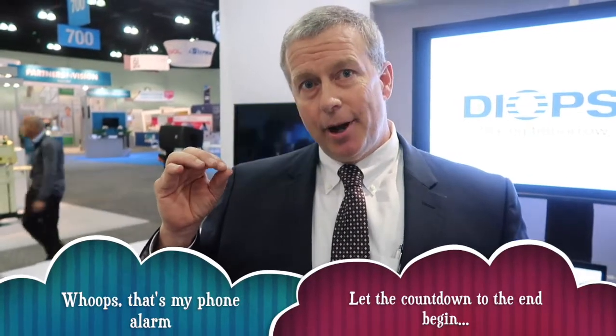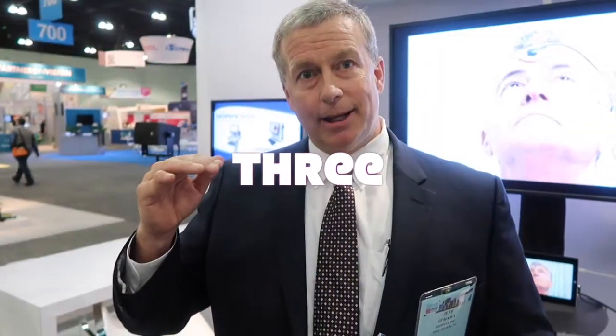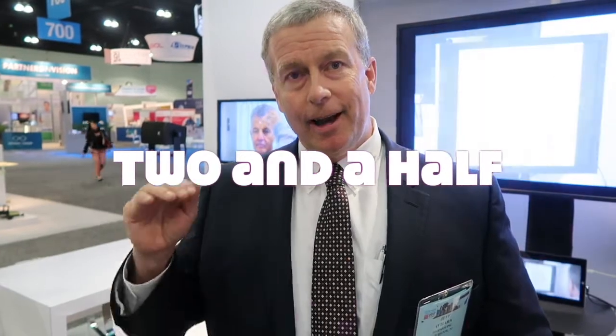So if you want objective data on function, let's say you were testing somebody with the ERG, the ganglion cell electroretinography test. If a cell were sick and you hit it, I don't know, with my favorite laser, the SLT laser, because I have a little experience with that. If you hit it with an SLT laser, then maybe in 60 or 90 days you'd want to know how the intervention impacted the patient. So when you hit a cell that was sick or stressed, underperforming function-wise, post-SLT or a drop, you can see you got its function back. Unlike an OCT, which is a structure test, alive or dead, this test will tell you when a cell is stressed or sick, and if you treat it, maybe you can get some progress there and have a tool to prove it.